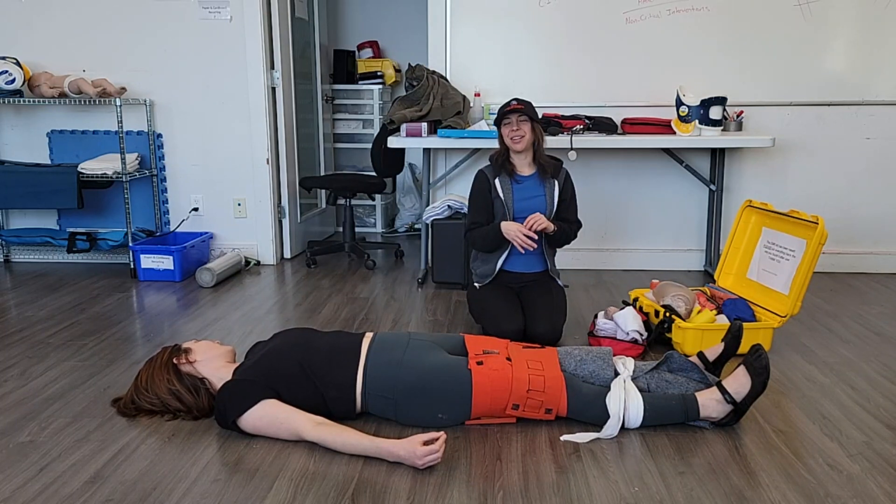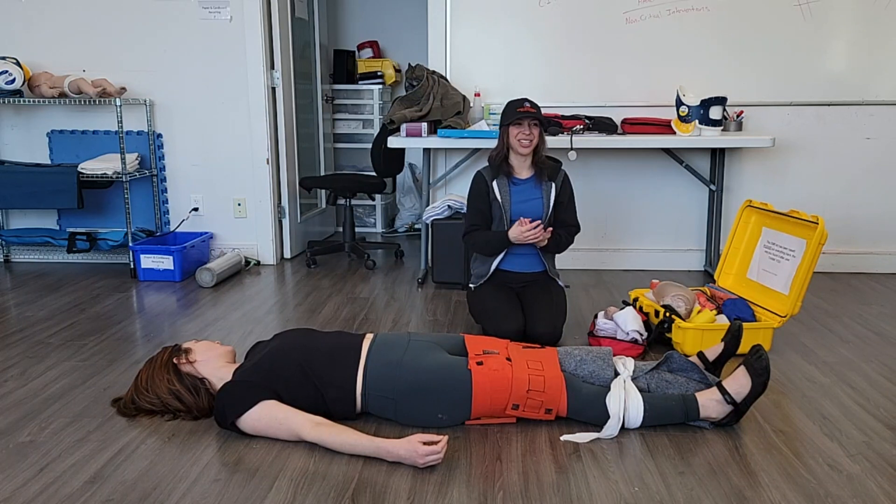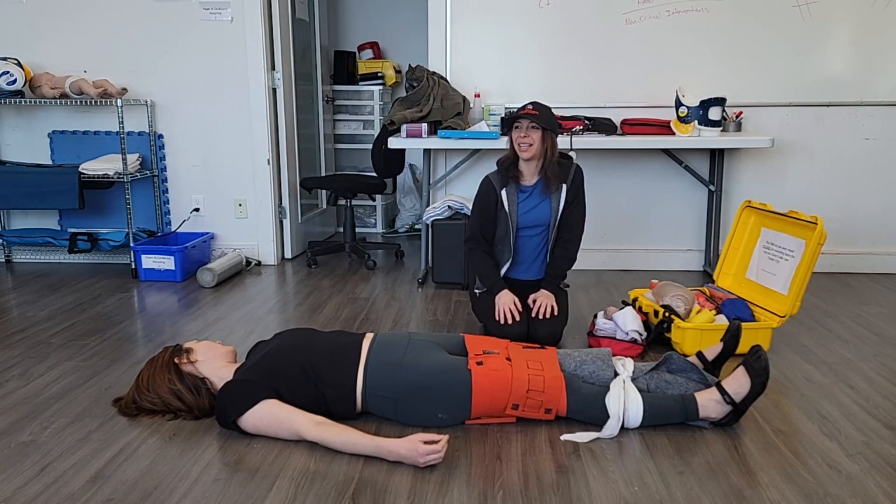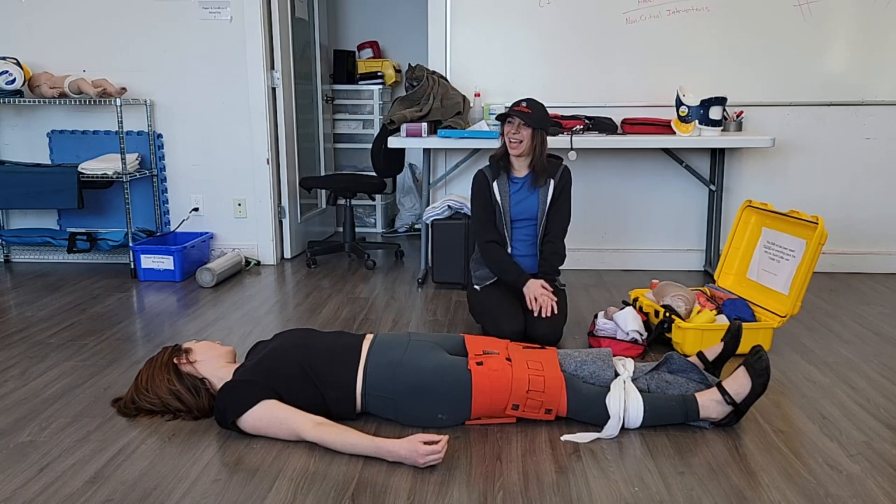This is very different from our pelvic fracture packaging. The big differences are: we're not using the pelvic binder for the hip, and we want to put a blanket in between the legs for the anatomical splint.